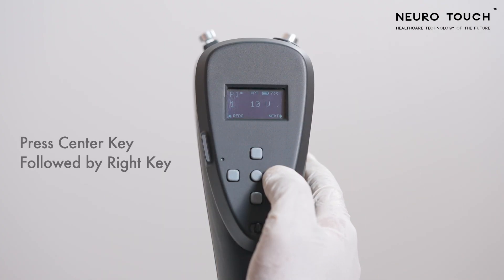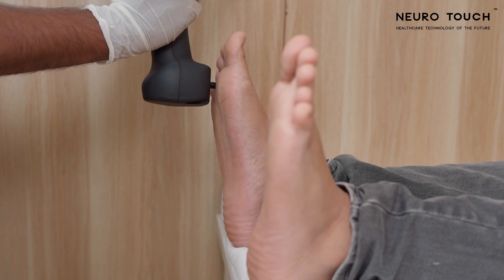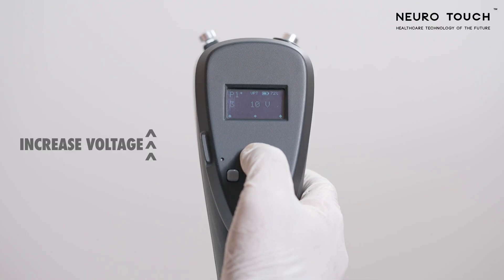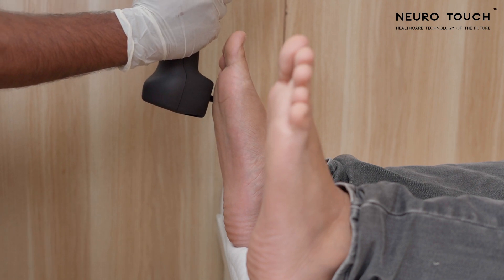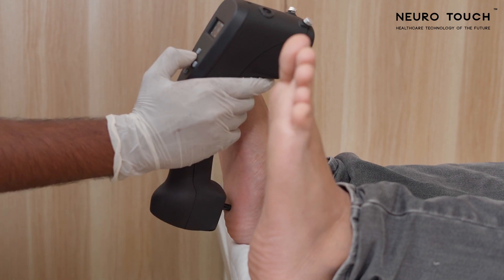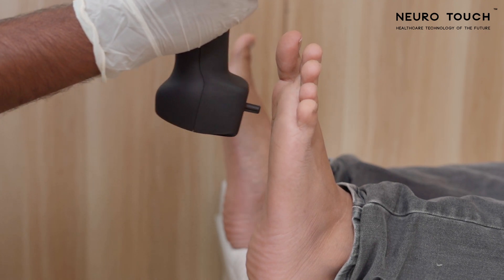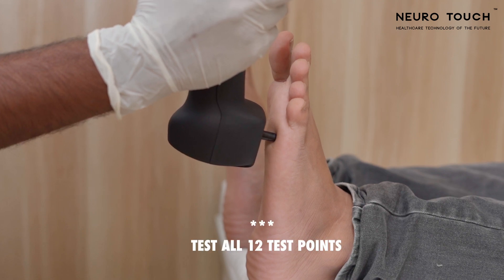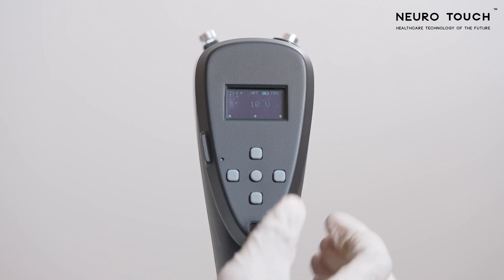When the probe is placed on the test point, the patient should feel a mild vibration. If the patient can't feel the mild vibration, increase the voltage by clicking the up key, place the probe again on the same test point, and take feedback from the patient. If the patient can feel the vibration, save the data by pressing the center and right keys. The test will proceed to the next test point. After screening all 12 test points, come back to the home screen by long pressing the left key.